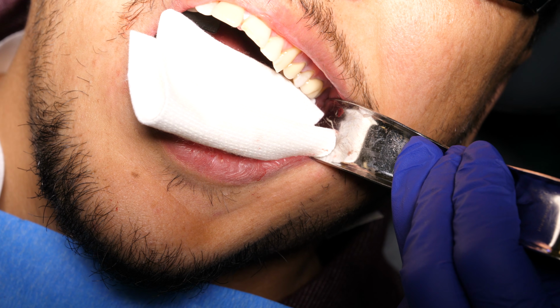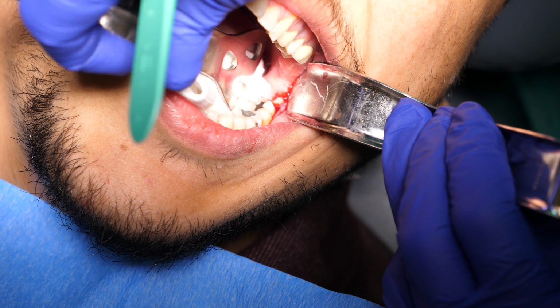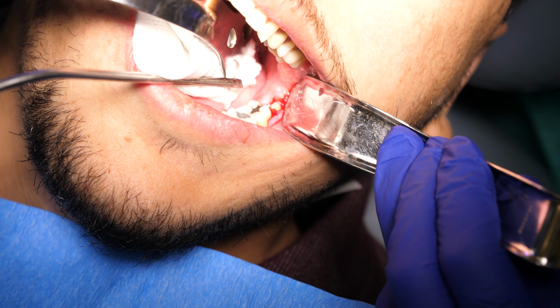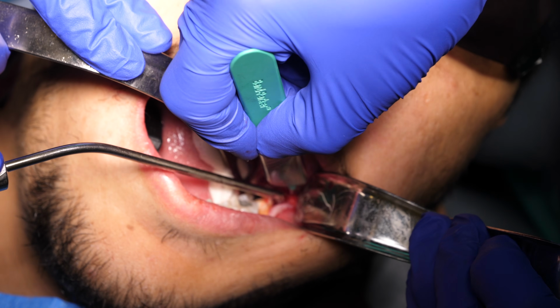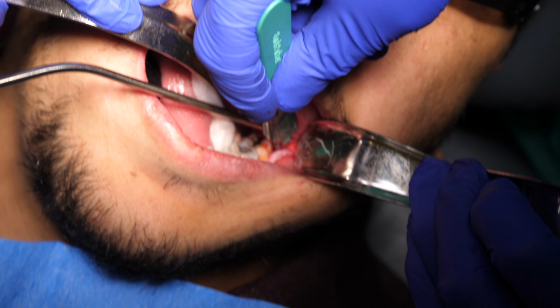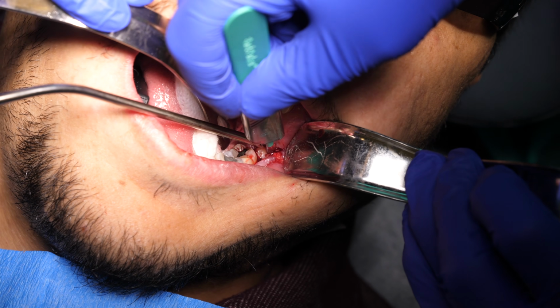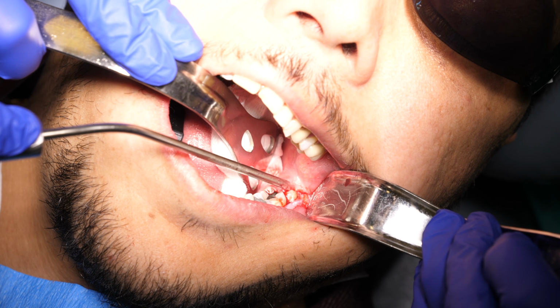As with all extraction and surgical procedures, placement of the throat pack is absolutely necessary to prevent swallowing or aspiration of any foreign objects. Placement of a flap is necessary for visibility and access to the wisdom tooth. A sulcular incision is made with the number 15 surgical blade starting from either mesial of the first or second molar. The length of the flap will depend on the impacted third molar and reflection of a tension-free flap.